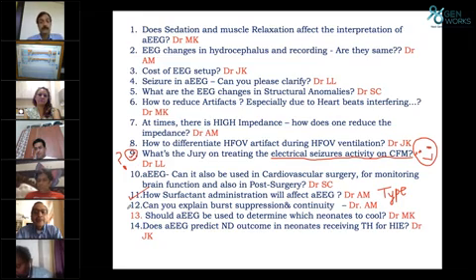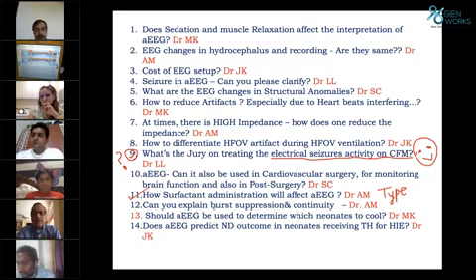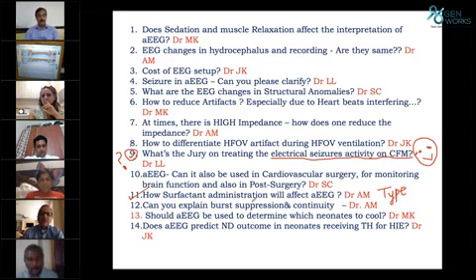In terms of burst suppression and continuity, these are concepts that look at the interval on the EEG of these babies. If you look at the intervening period between the bursts, there's a spurt of activity, then a quiescent period, and then a spurt of activity again.